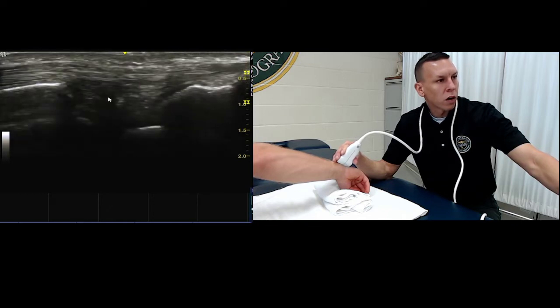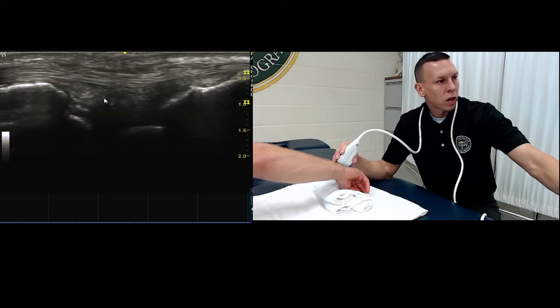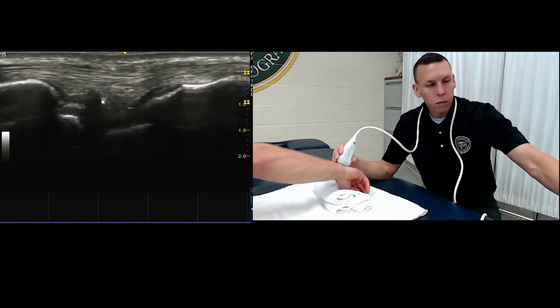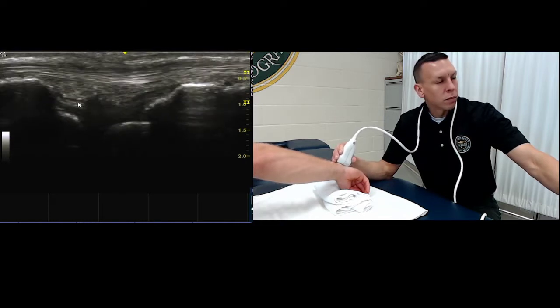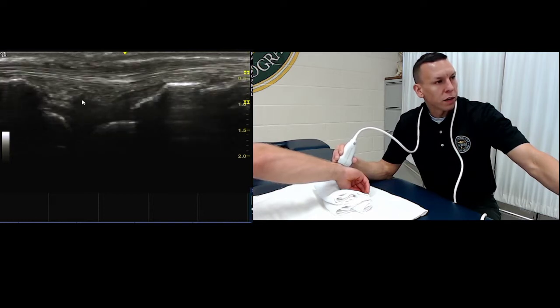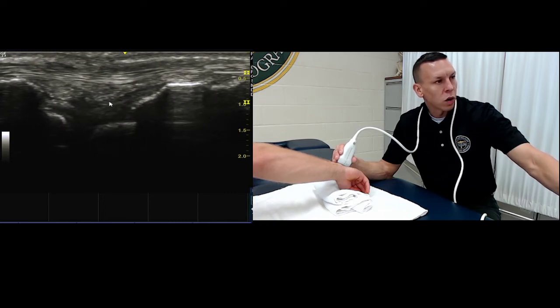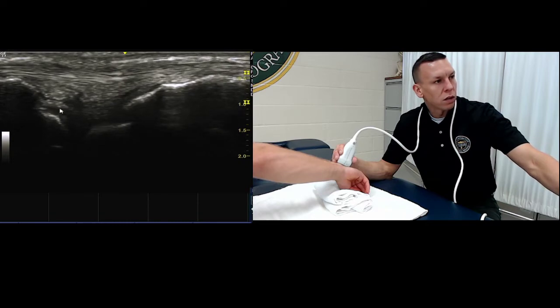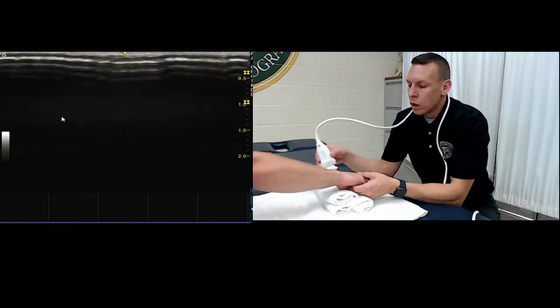Okay, and you can toggle your probe to try to make it appear a little bit more. You can move a little bit more to the dorsal; I find I can get a little bit better of an image there. And you can see these are all ligaments and connective tissue in here, and then right here is the area of the TFCC.